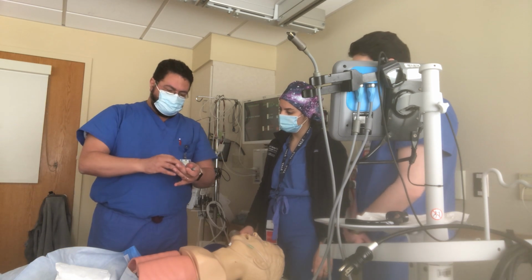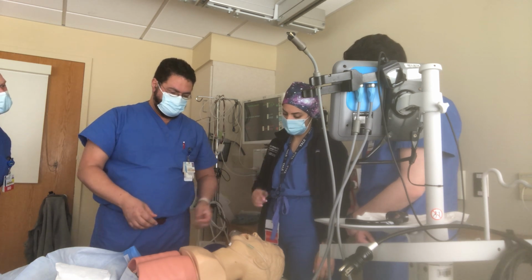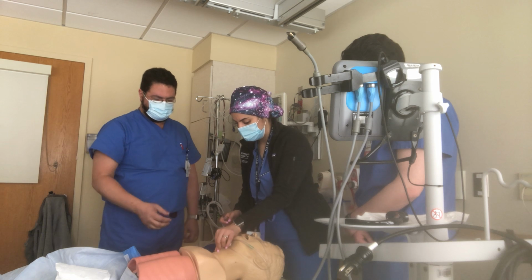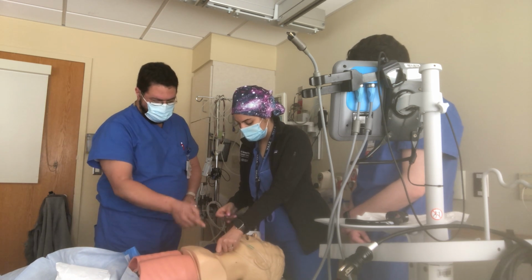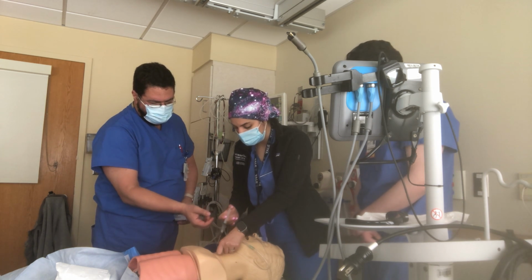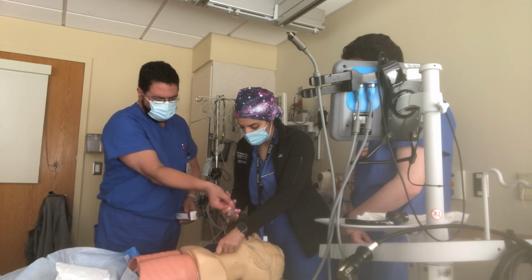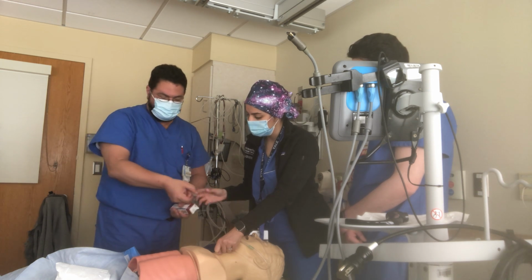So first we'll put some water into this. Right? And you do the same thing with the left hand, and you come from above. Of course, we're not gonna puncture this guy because it's not supposed to be punctured. And then you're gonna go 60 degrees angle like this, as you're aspirating. Like this. Yeah, as you're aspirating, right? So you put your finger, wait. You have to do it like this. So with this finger you can aspirate.